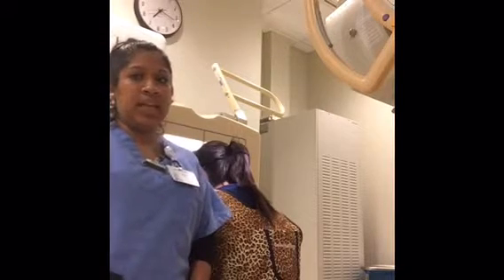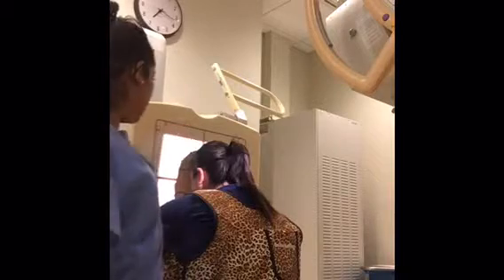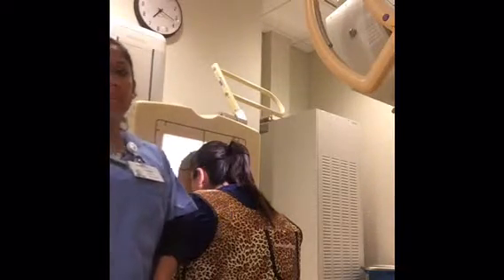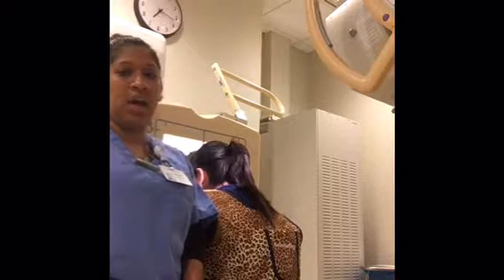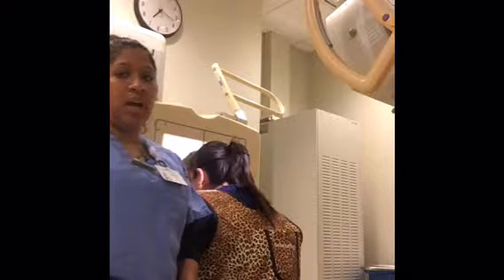And we're using a 10x12 lengthwise cassette. So we can see that we collimated to a 10x12 and it's lengthwise. The position for the patient is with the forehead and nose touching the IR, and our MSP and OML are perpendicular to the IR.